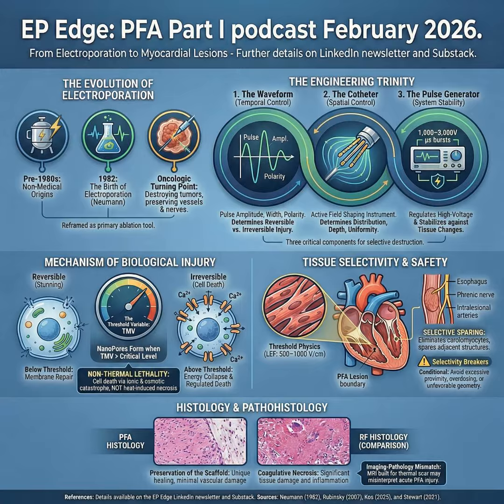I'm Dr. Sharma, and this is the start of a 3-part EP Edge comprehensive analysis on pulsed field ablation, PFA. Let me frame what we're doing, because this isn't going to be a here's-the-shiny-new-catheter episode. This is meant to be a grounded EP-level review: history, mechanism, trials, and then complications.